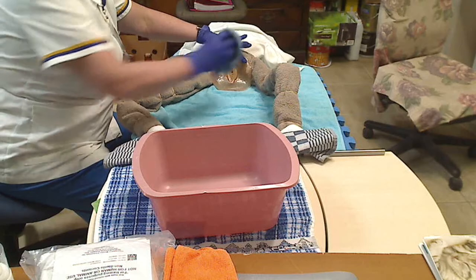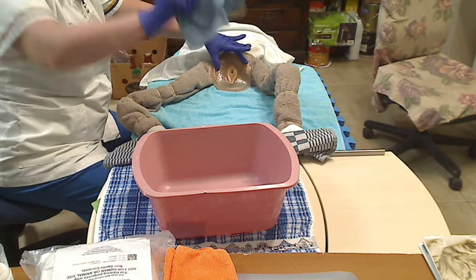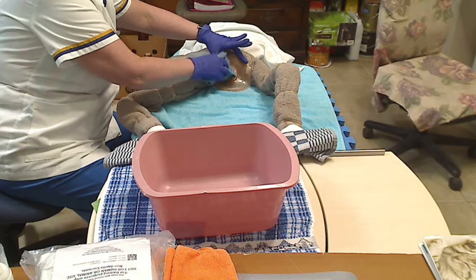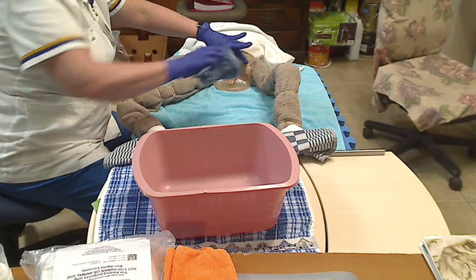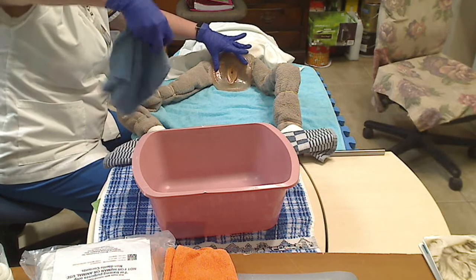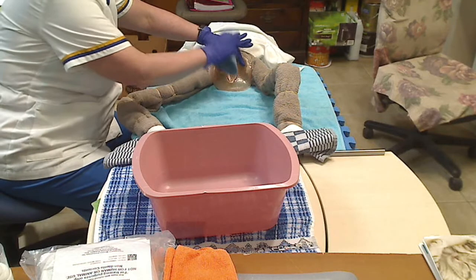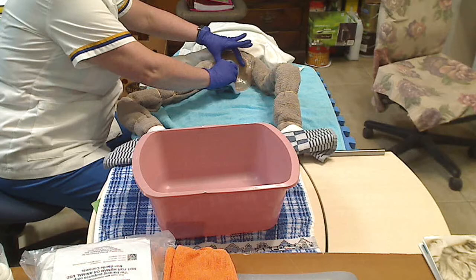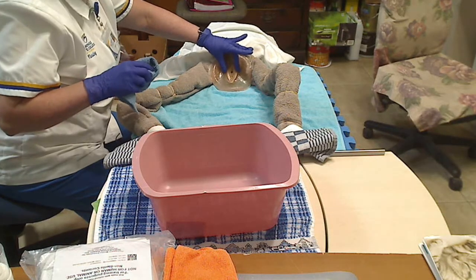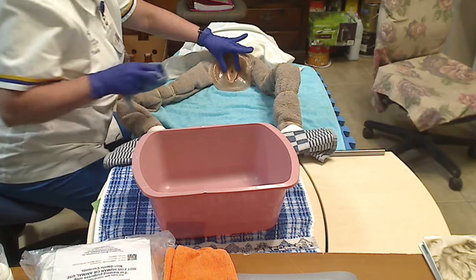So I'm going to go to the distal side and wipe down. I'm going to rotate my rag. I'm going to come to the proximal side, wipe from top to bottom. I'm then going to take my rag and I'm going to turn it inside out. And I am going to wipe straight down the center. As I'm cleaning her, I'm also noting that I have identified the urinary meatus. It is exactly where it's supposed to be. I can find it nice and easily.